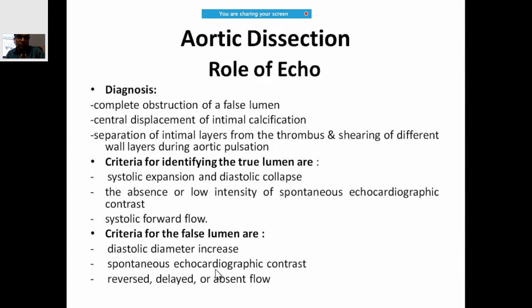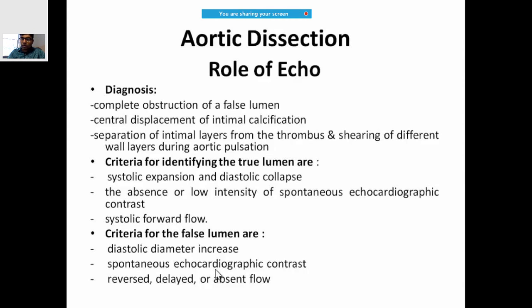To diagnose aortic dissection on echocardiography, look for complete obstruction of the false lumen, central displacement of intimal calcification, separation of intimal layers from thrombus, and shearing of wall layers during aortic pulsation. To differentiate true from false lumen: systolic expansion with diastolic collapse indicates true lumen; absence of spontaneous echo contrast or systolic forward flow also indicates true lumen.